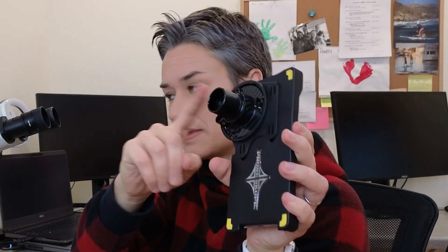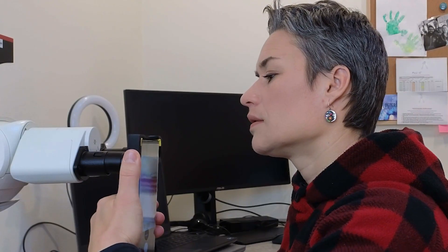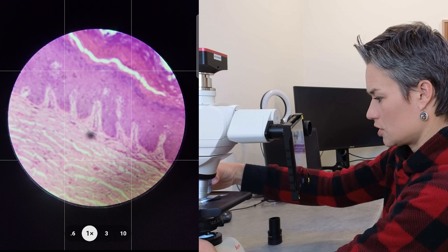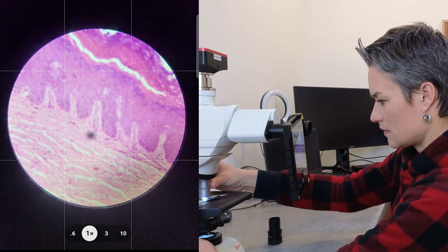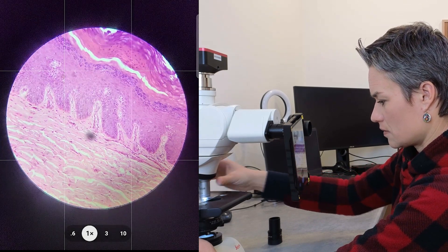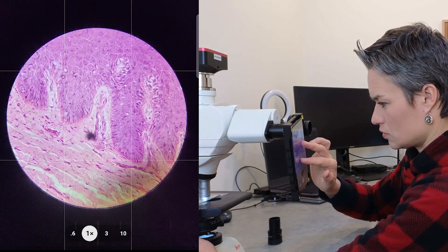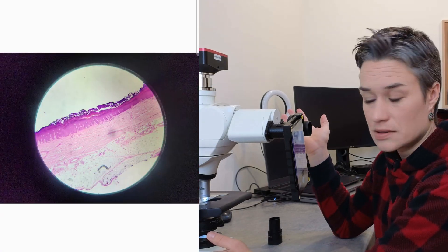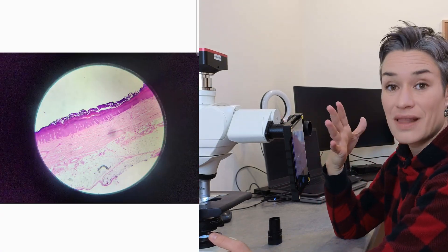Then you put the eyepiece adapter on, and now you have something that replaces your eyepiece. You take the eyepiece out, put it into the ocular, change magnification, adjust the focus, take a picture, zoom in, and take your diagnostic pictures just like that — super fast.